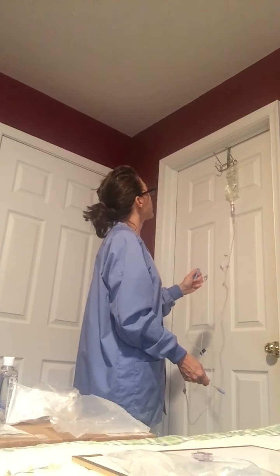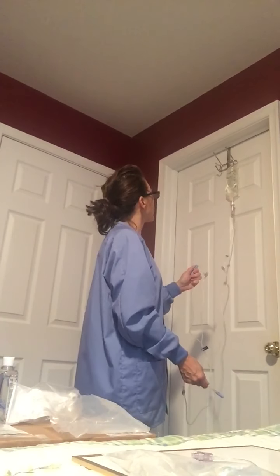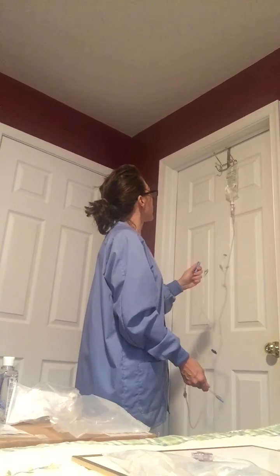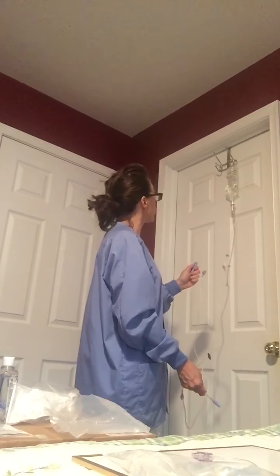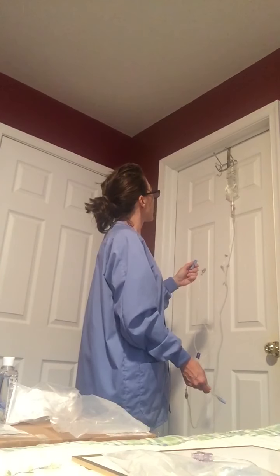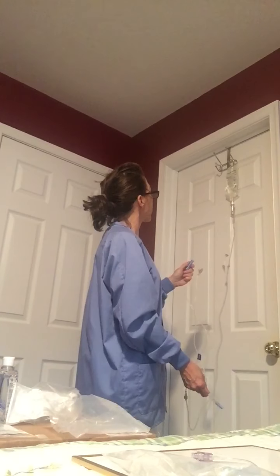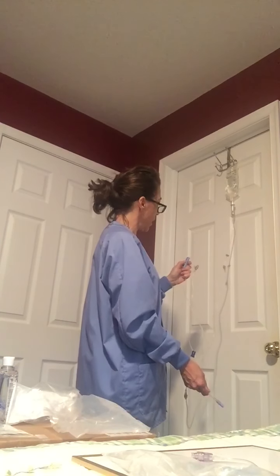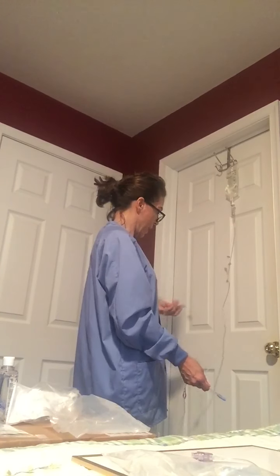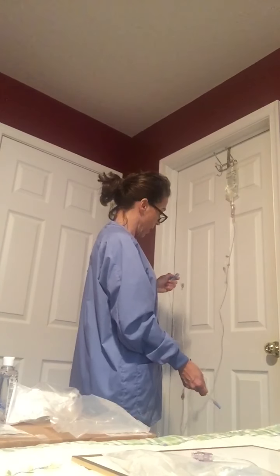I want to be watching my fluids here. I want to make sure there's no air in my tubing. I'm going to try to do this slowly and have this fluid move through this primary tubing and push out any air that may be in there. We don't want air in the tubing.